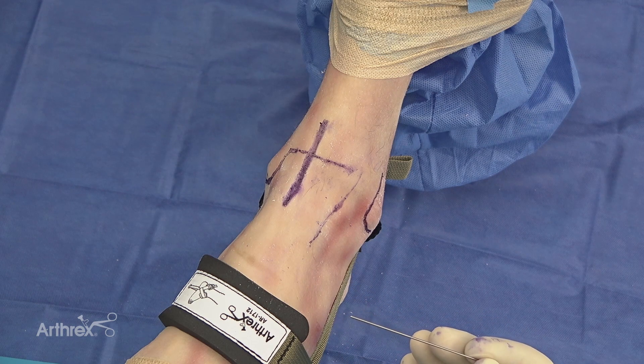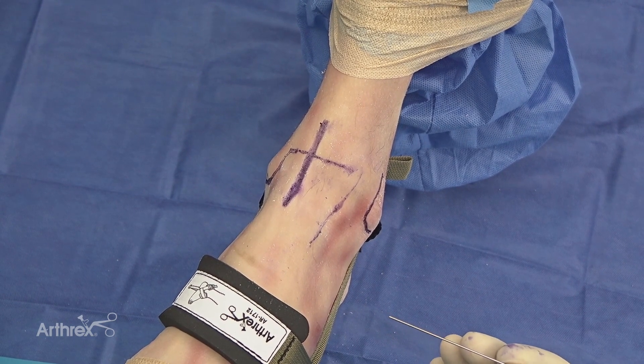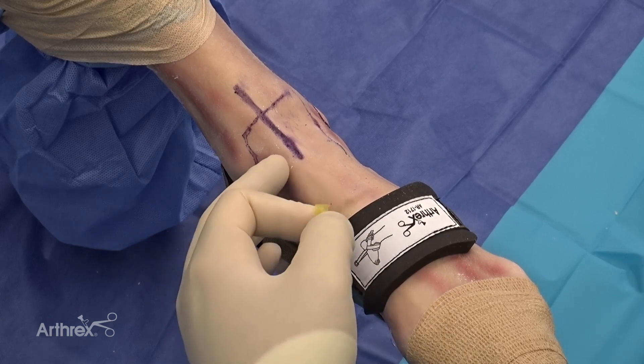An SPN nerve injury is one of the most common complications from ankle arthroscopy, and it will be very important and critical to not only mark it out but also avoid it during any sort of surgical approach.